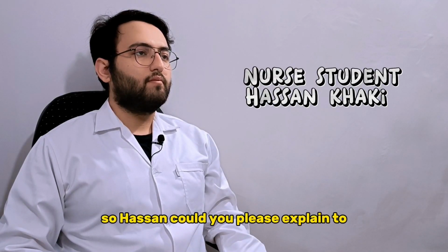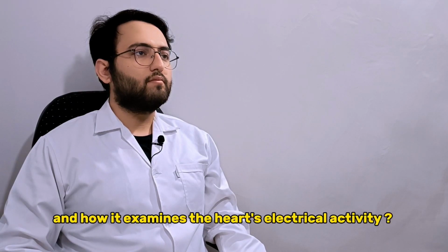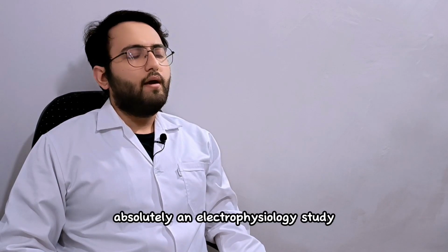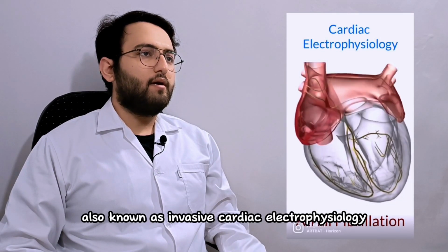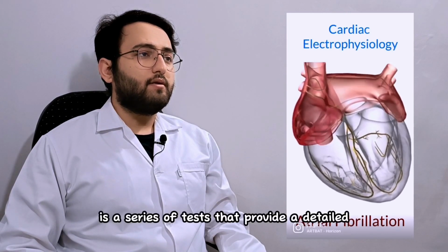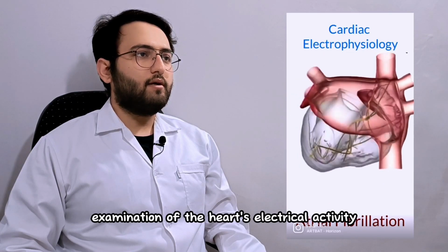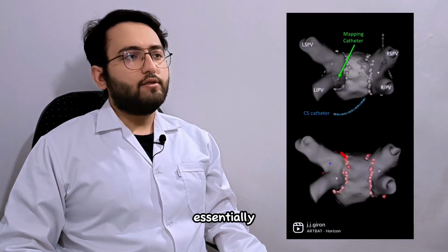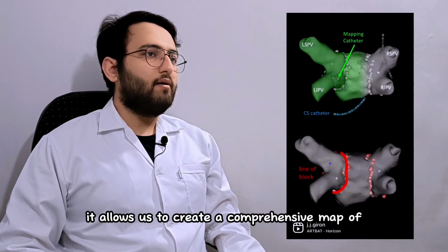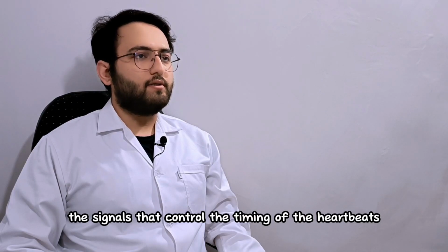So, Hassan, could you please explain to our viewers what an electrophysiology study is and how it examines the heart's electrical activity? Absolutely. An electrophysiology study, also known as invasive cardiac electrophysiology, is a series of tests that provide a detailed examination of the heart's electrical activity through cardiac catheterization. Essentially, it allows us to create a comprehensive map of the signals that control the timing of the heartbeats.